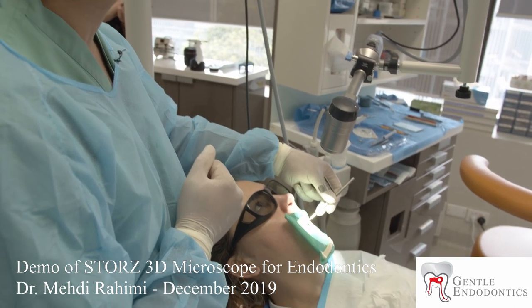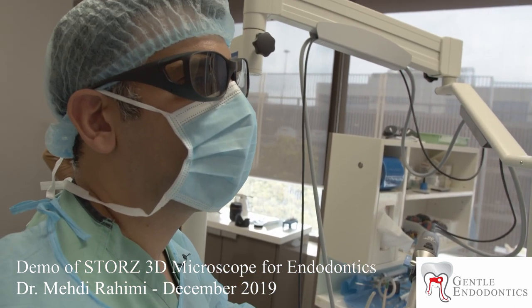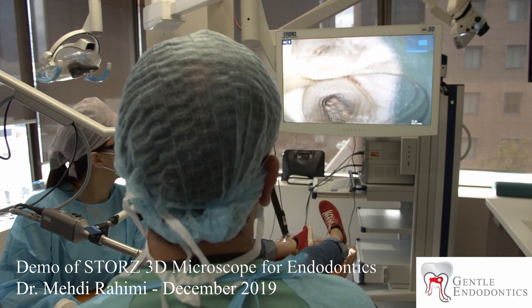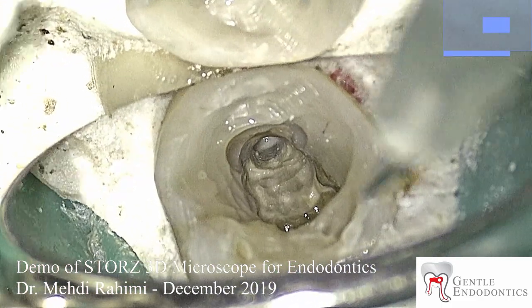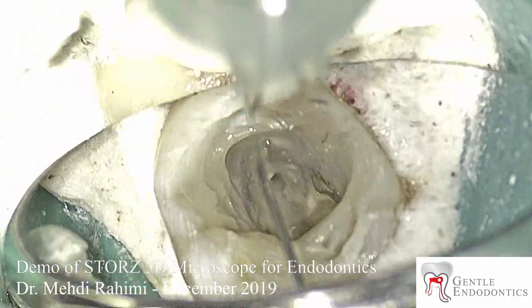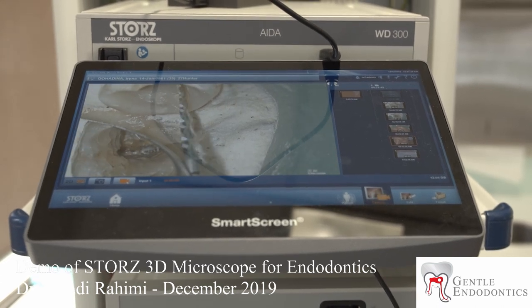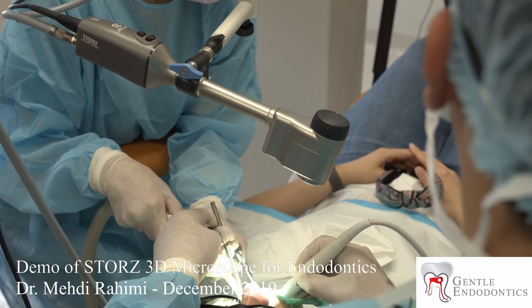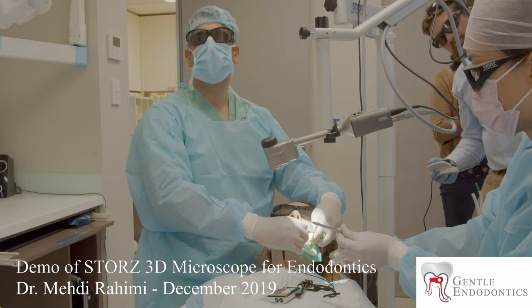Okay, where's... A little bit more adjustment. Usually it's got Russian red and it's red, but the material is very hard to remove from the root canal — the infected root.